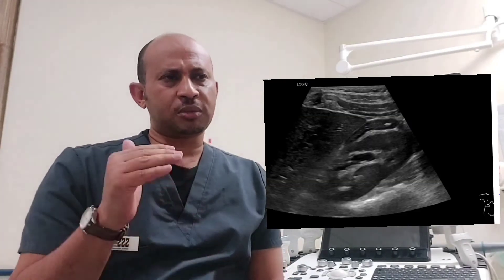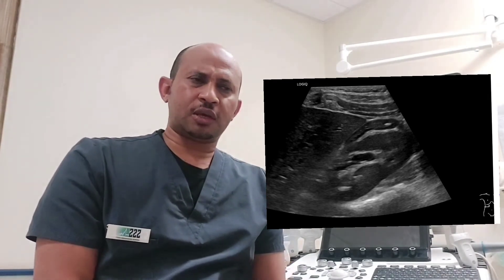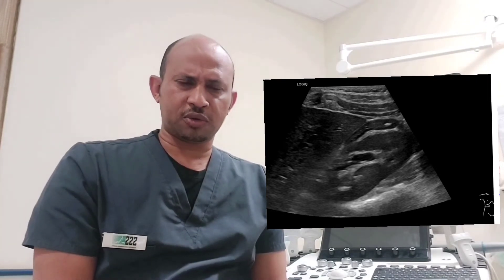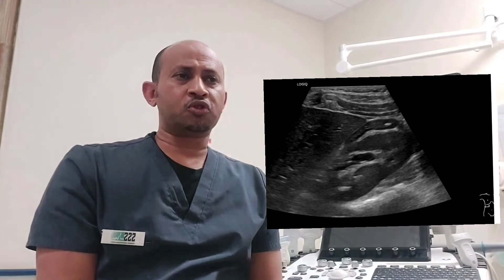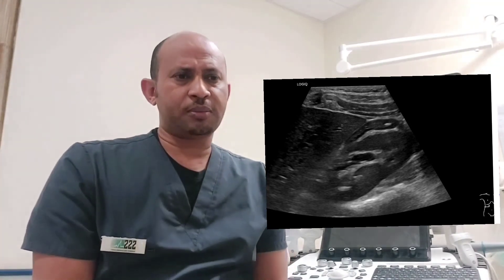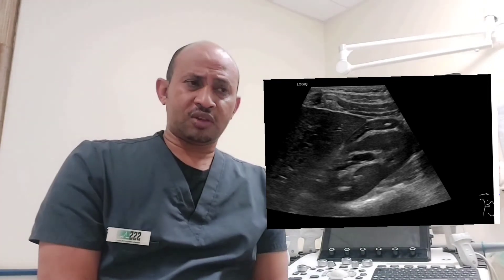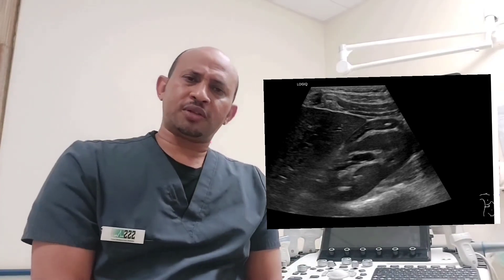At seven millimeters, it is a little above the borderline of six millimeters. There was an intraluminal appendicolith of approximately four millimeters in this case. Because of the pain, there was no significant guarding — the pain was a little vague — and this patient was managed conservatively for two days, then discharged with follow-up instructions in case the same pain returned.